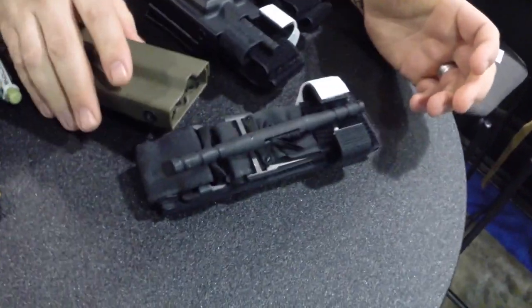Now if you're worried about retention, retention is solid. We've jumped these things both inverted and regular — so upside down and right side up. We've got no shift, no movement in the tourniquet from about 1700 feet.